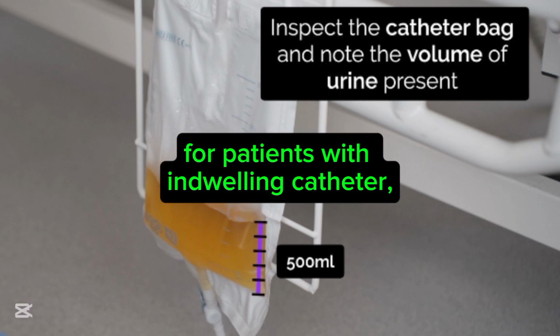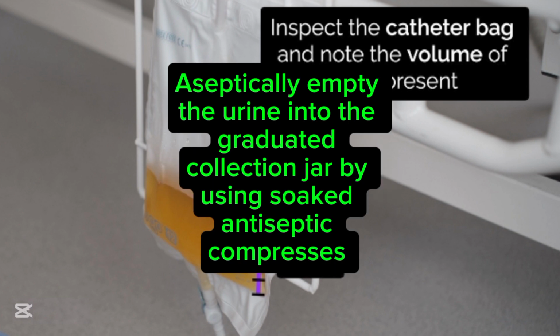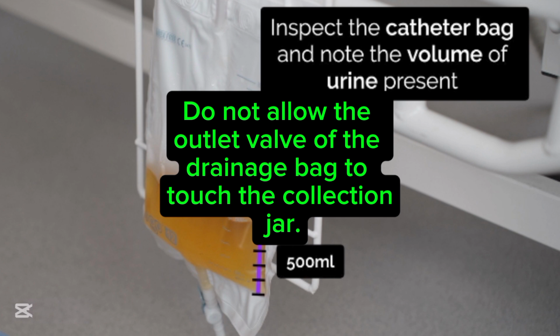For patients with an indwelling catheter, aseptically empty the urine into the graduated collection jar by using soaked antiseptic compresses. Once the drainage bag is full, do not allow the outlet valve of the drainage bag to touch the collection jar.